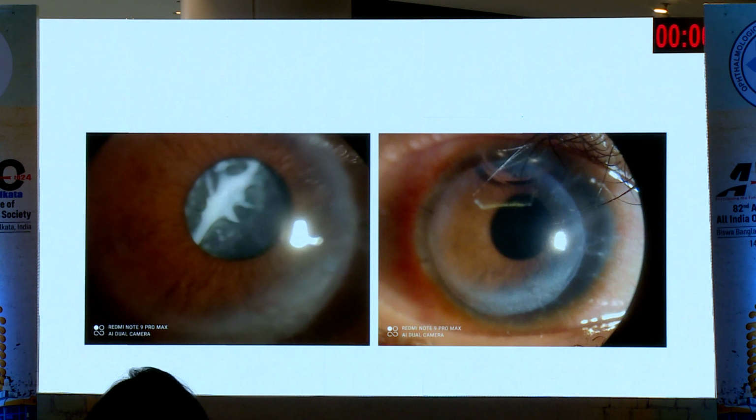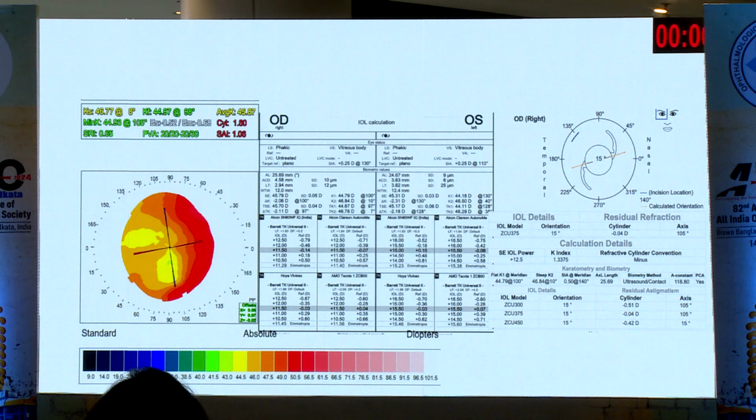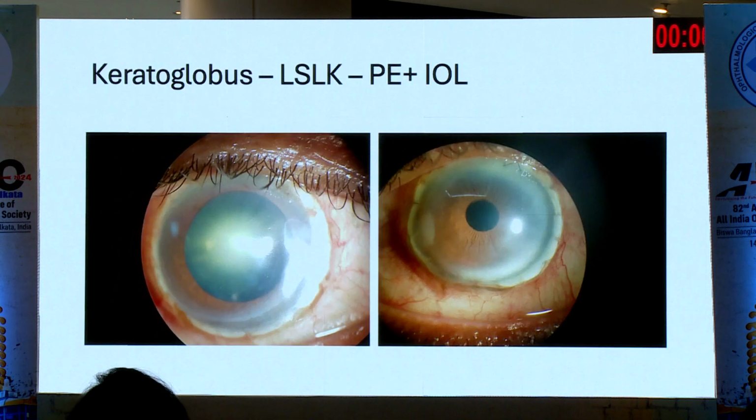So this was a patient who had a PK. Patient was a patient with atopic keratoconjunctivitis. Somebody had planned an LK, but it ended up with a PK. So PK part was fine, sutures were out, but she has a shield cataract. So we went ahead and did a toric IOL. It's not a very regular bow tie, but it was kind of matching the refraction that we had, and we went ahead with a toric lens, and she ended up with a 0.75 cylinder, improving to 6/6.